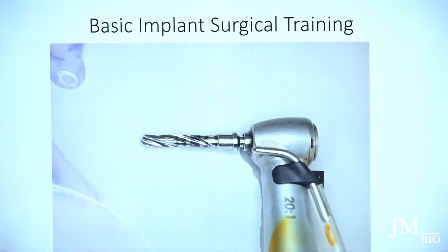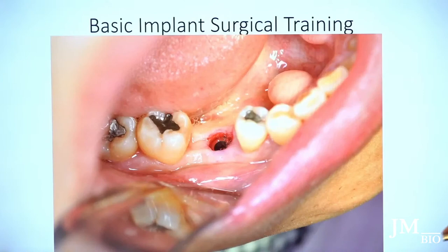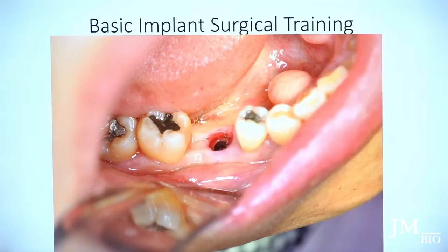The implant starts to go in. This is a big implant — a 6.0 by 10. I hand-drive it in and check with the curette, going around to see if I'm at the proper depth. Because there's no flap, it's hard to see, so I feel for the buccal plate and use the curette to check. Then I place the healing abutment on top.